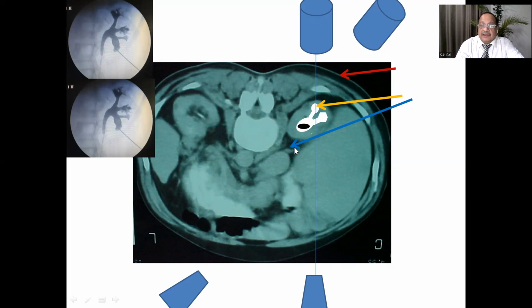And vice versa. If your needle tip, which was seen at the target at 30 degrees, moves medial to the target in the next image once you have moved your C-arm from 30 to 0, then this is a deep needle, it has gone too deep. You will have to come out and make a superficial puncture.